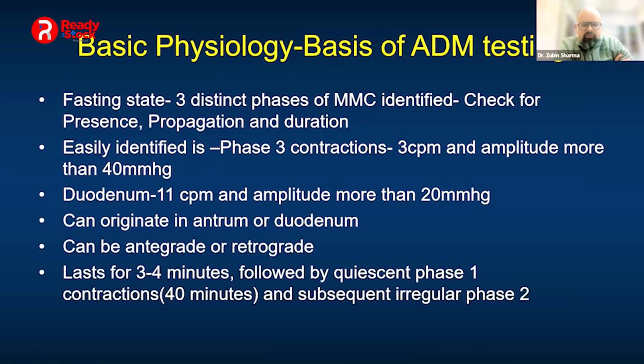So what do we do on the fasting state? You can see 3 distinct phases of MMC. What you have to check for is whether they are there or not, presence of MMC.